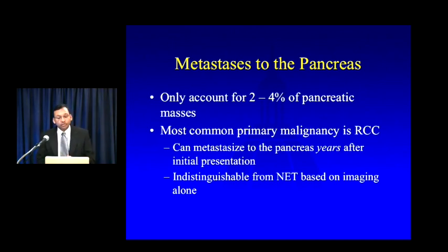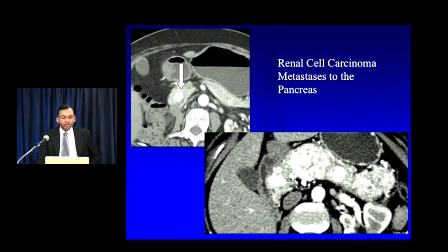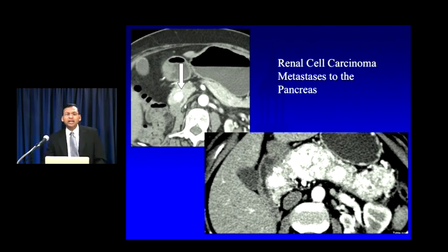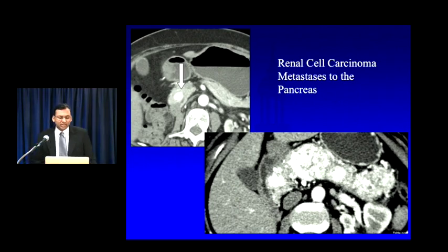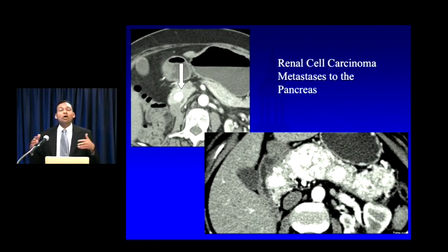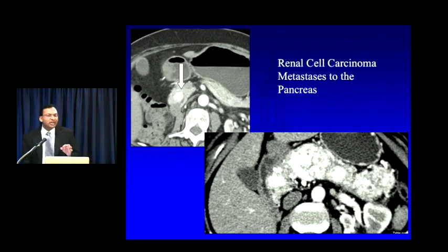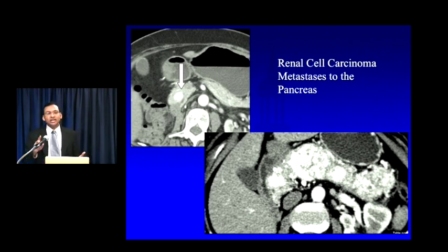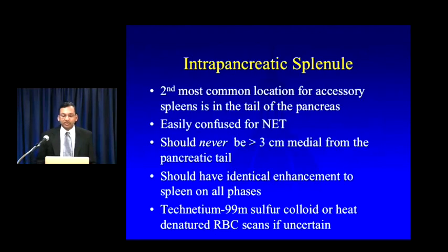The most common mimic of a pancreatic neuroendocrine tumor — and one that comes up frequently in my practice — is metastatic disease to the pancreas, classically renal cell carcinoma. RCC can metastasize to the pancreas years after initial presentation, and because clear cell RCCs are fundamentally hypervascular tumors, a hypervascular RCC metastasis will look indistinguishable from a neuroendocrine tumor on imaging alone. What drives you to the right diagnosis is the patient's history. Here are two examples — both look like NETs — but in both cases, the right kidney is missing: this patient had a prior nephrectomy, and these are RCC metastatic lesions.